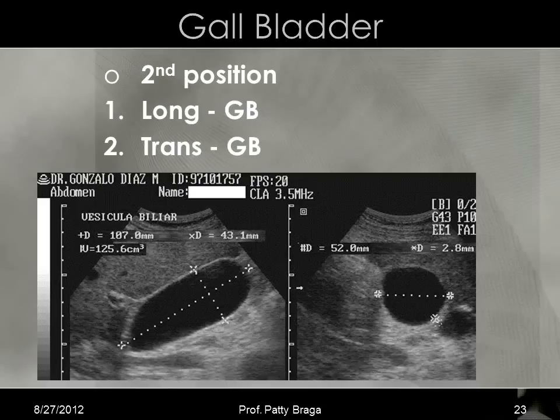We always turn the patient up either oblique, halfway up, or all the way up in a lateral decubitus, maybe even sit them up depending on what we're trying to achieve on our images, and then take the same images in that position that we took supine.